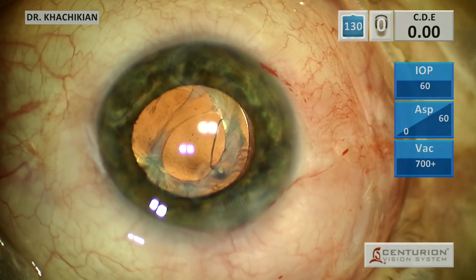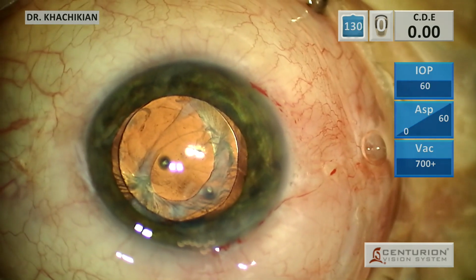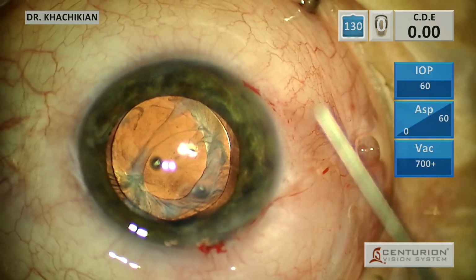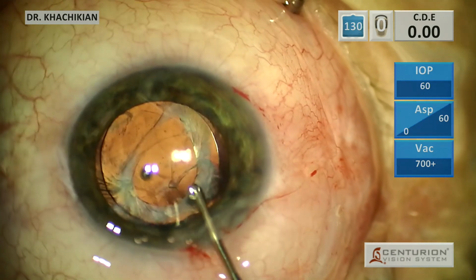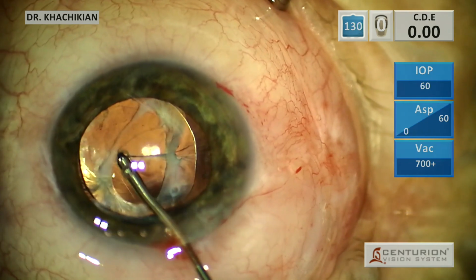But again, the more fibrosis you can remove, and you'll be surprised how much fibrosis you can remove just by peeling it, the less likely this is to reoccur in the future. So we'll grab our MST micro graspers or micro capsular rhexis forceps and pull. You do have to pull aggressively. Sometimes it's a little bit uncomfortable, but you'd be surprised at how much stuff comes off of there.